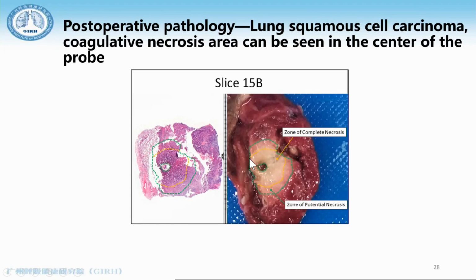Here we can see the necrosis is also about 1.5 centimeters, so the necrosis area is also limited.